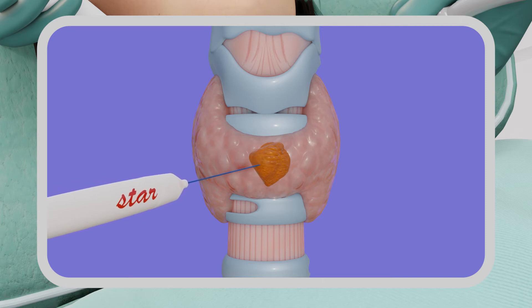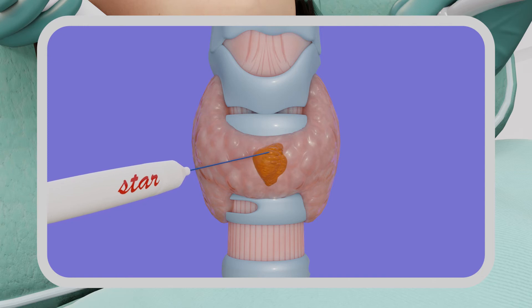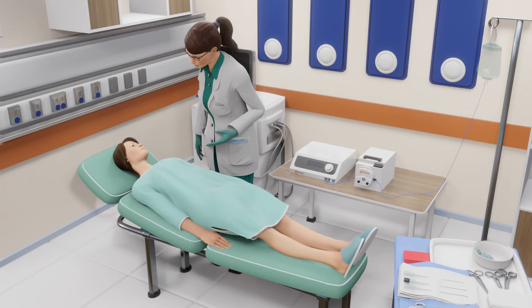The doctor will perform the procedure by moving the electrode throughout the nodule and monitoring the status of the ablation using real-time ultrasound imaging. During the procedure, the doctor or nurse may ask you to speak from time to time to ensure that you are comfortable and to detect any voice changes.